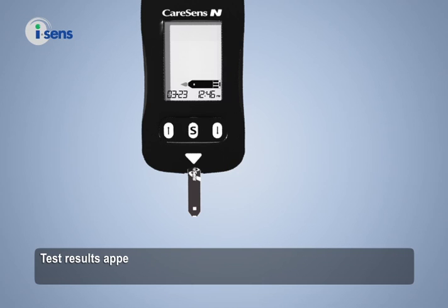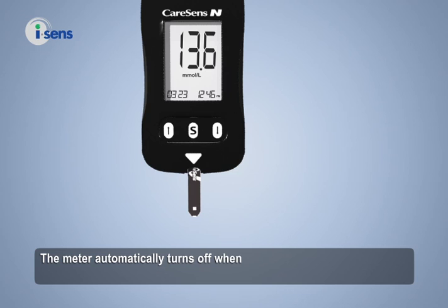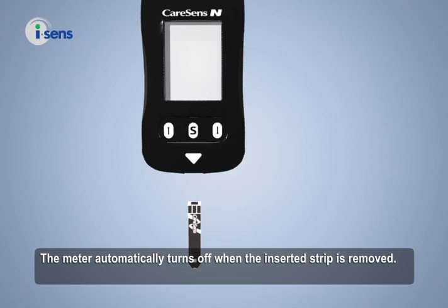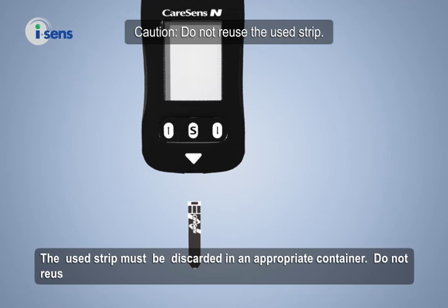Test results appear after the meter counts down for 5 seconds. Data is then automatically saved. The meter automatically turns off when the inserted strip is removed. The used strip must be discarded in an appropriate container — do not reuse the used strip.